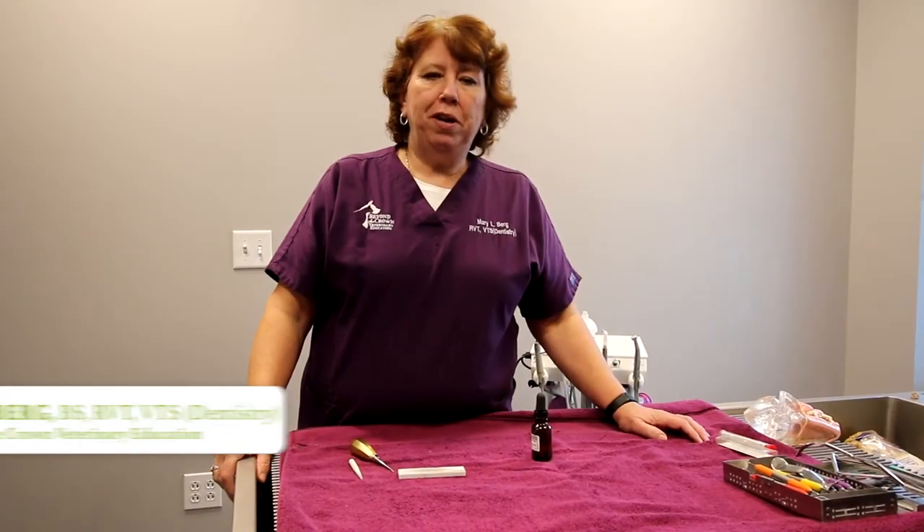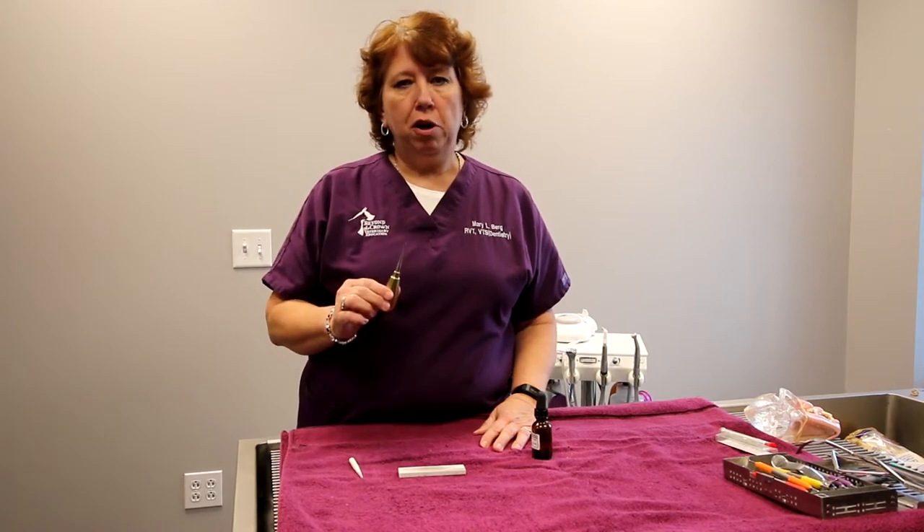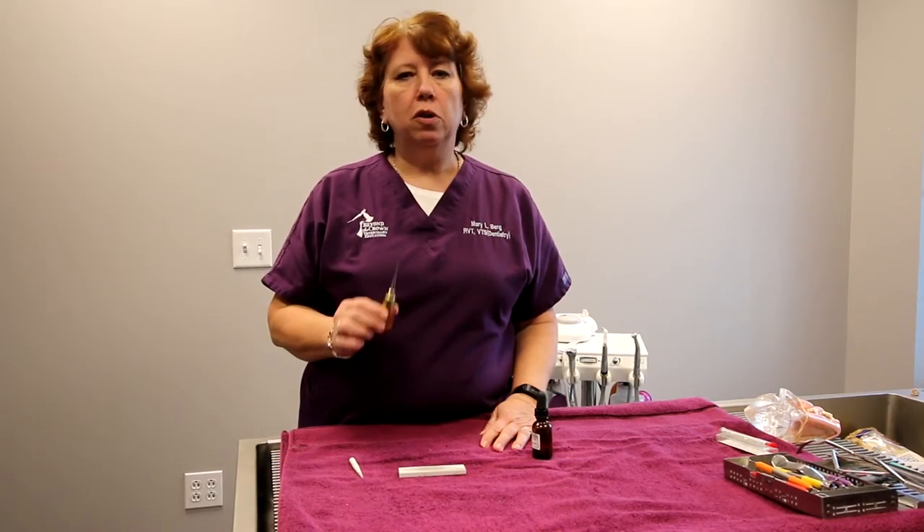Hi, I'm Mary Burt with Beyond the Crown Veterinary Education. I'm an RVT and a VTS in dentistry. I want to talk to you today about sharpening our dental elevators. A sharp instrument makes the procedure go so much better.